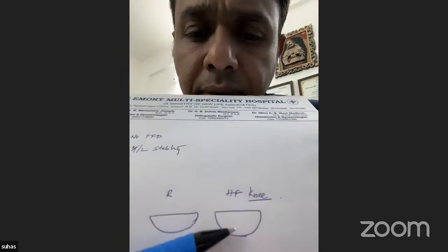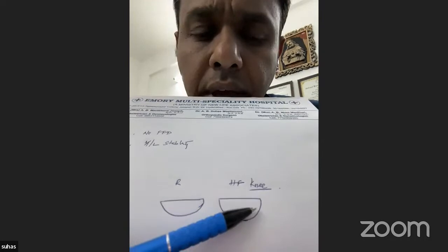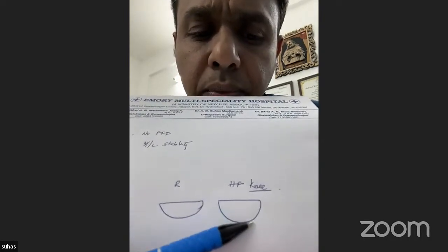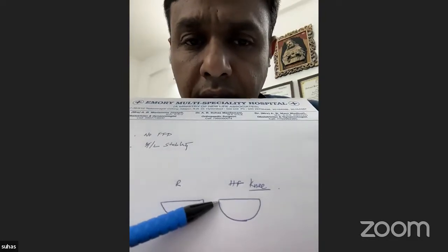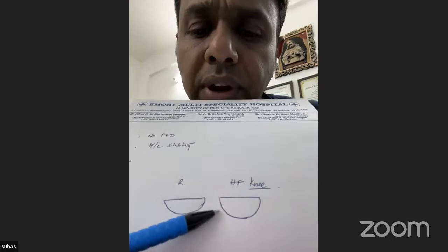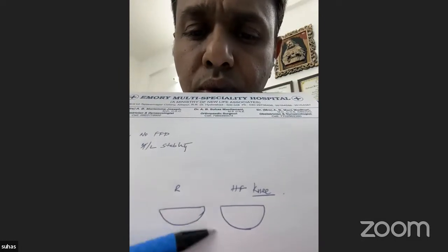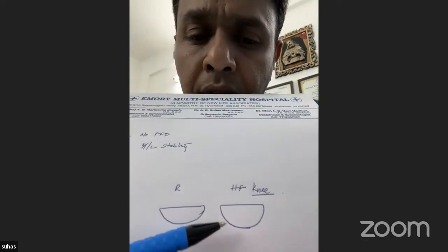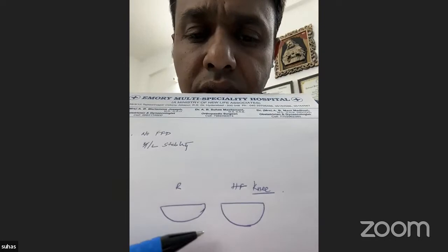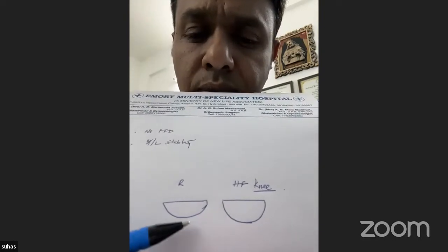So this is a high flex design where you're cutting more of the posterior femur, and that is getting filled by a femoral component which has a larger radius of curvature. Theoretically speaking, it'll further flex and give you more flexion versus a normal cut, usually 2 to 3 mm more cut. But clinically speaking, not a single study has shown that you have more flexion with high flex knees versus normal.